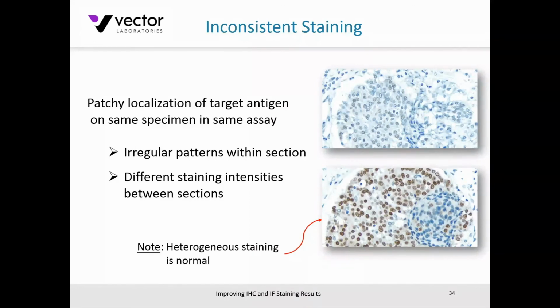But importantly, one thing I will say is, don't blame the detection reagents. It's not like the detection reagents are saying, I'm just going to stay in this section and not this section. They don't do that. So the detection reagents are obviously working here, everything from primary antibody through to detection reagents, the enzyme substrate. And so you're going to have to look further afield. But one thing I'll point out, this heterogeneous staining pattern is quite normal for immunofluorescence, immunohistochemistry. So don't try and solve for this problem within a section, solve for this particular difference that I'm indicating here.